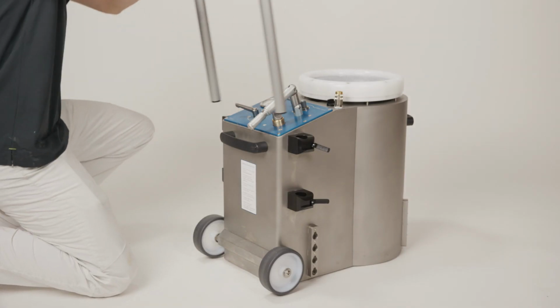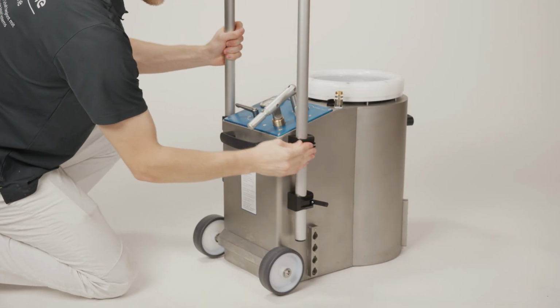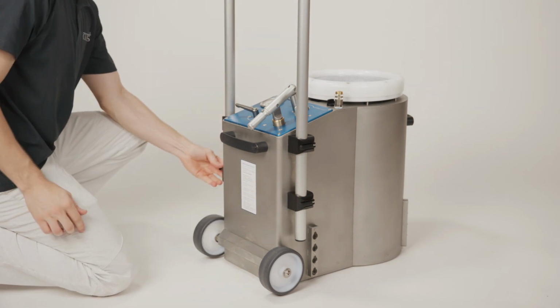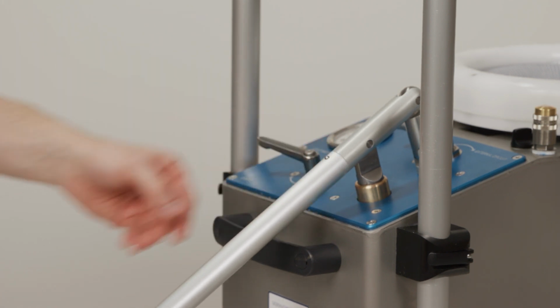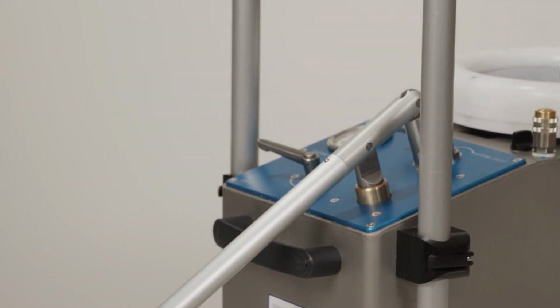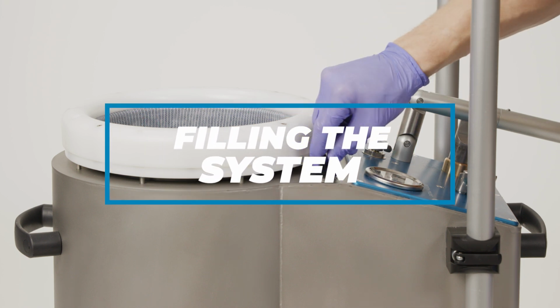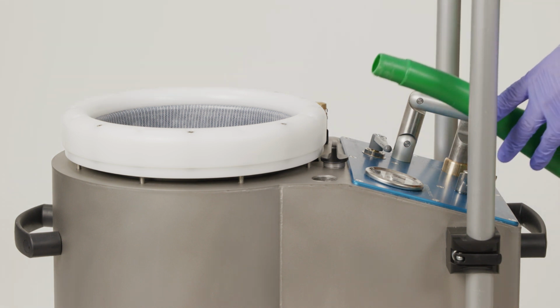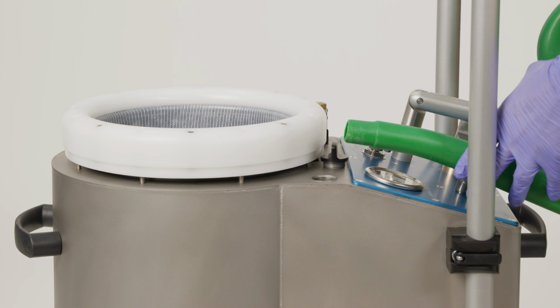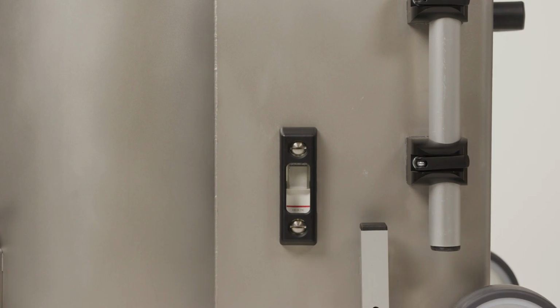Set the grip handle so that a secure and comfortable standing position is possible for the patient. Connect the lever for the pump to the coupling provided directly on the gauge panel. There are 2 possibilities for filling the system with water. On the upper side of the gauge panel, find the opening in which you can fill in water. Make sure to have clean water and fill until the filling level has been reached.